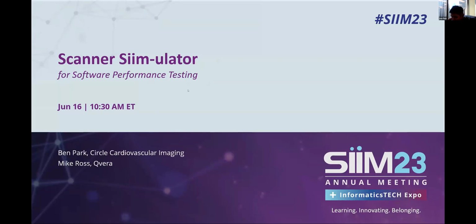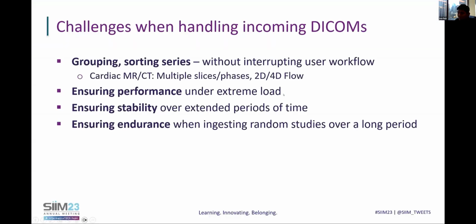So the project for this hackathon is a scanner simulator, and the purpose is we want to use the simulator for software performance testing. From a vendor's perspective, we build cardiac post-processing software for MRI and CT.